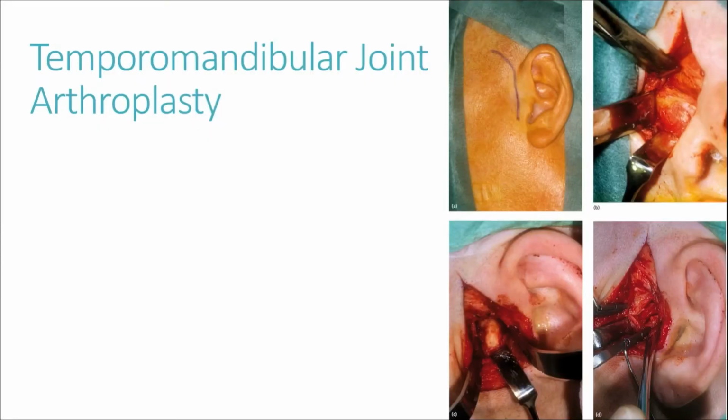The use of the holmium laser has been suggested for temporomandibular joint arthroscopic surgery. The surgery is to ablate tissue, remove degenerated fibrocartilage and chondrocytes, and make incisions.